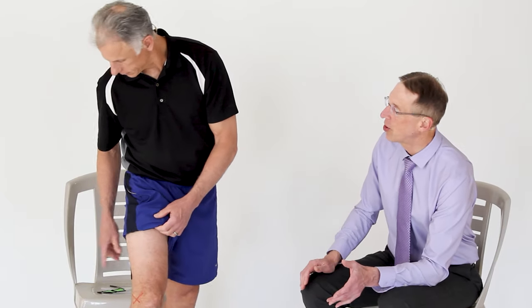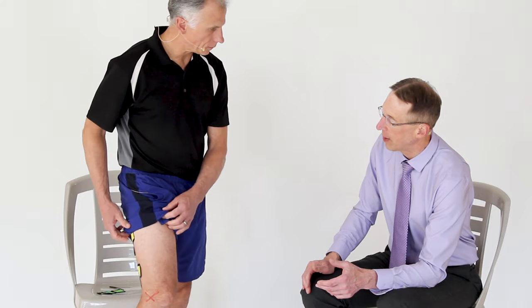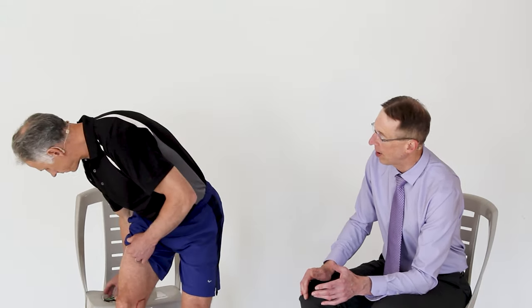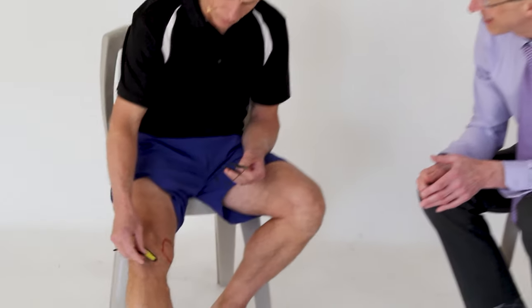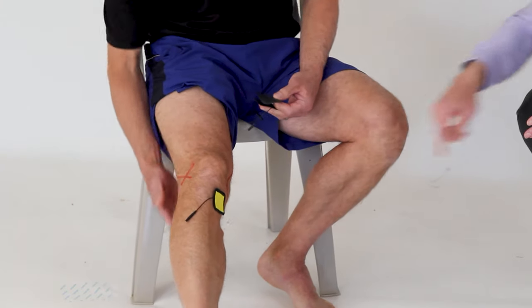All right, let's go to two channels now, Brad. Sure, yep. So we have two channels now, and you're going to be able to tell the difference because the yellow ones are channel one and the green ones are channel two. Why don't you have a seat, Brad? So we're going to first do the X. So you're going to take channel one. Well, you're taking channel two, Brad. Well, don't worry, Bob. We'll get it squared away. So channel one, you're going to put one on the right lower.